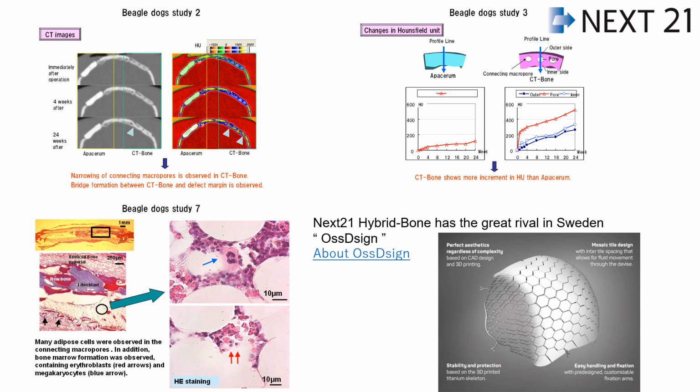The custom-made skull replacement bone graft integrated with a titanium mesh was developed in Sweden. 1. Only hexagonal external communication holes; it cannot create internal communication slits. 2. Titanium mesh is formed by laser sintering, so it is more fragile and easier to break than forged mesh. 3. Since beta-TCP is the main component, it does not have physiological activities such as bone induction, blood vessel induction, and cartilage induction like CT bone.